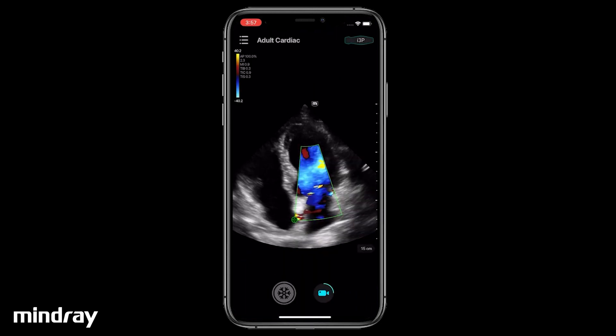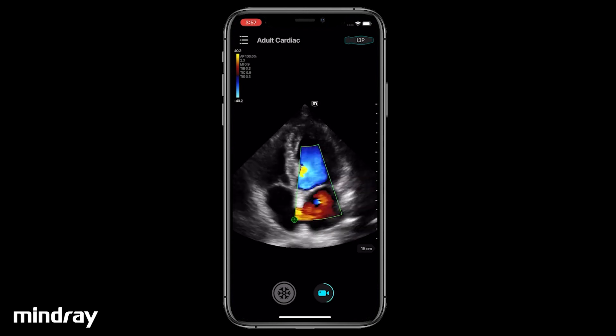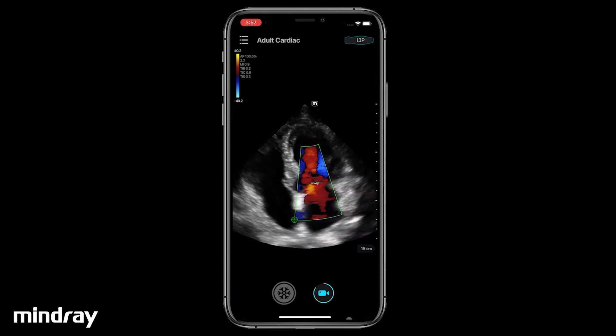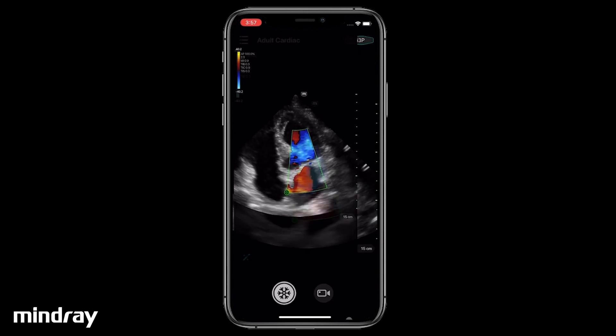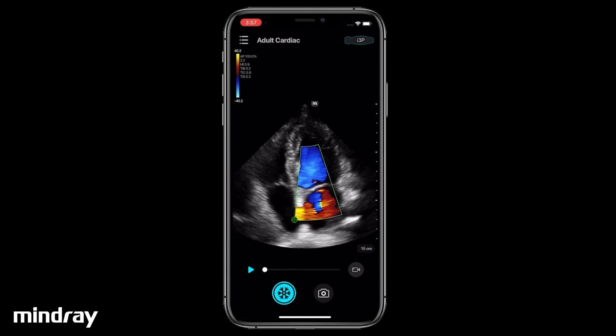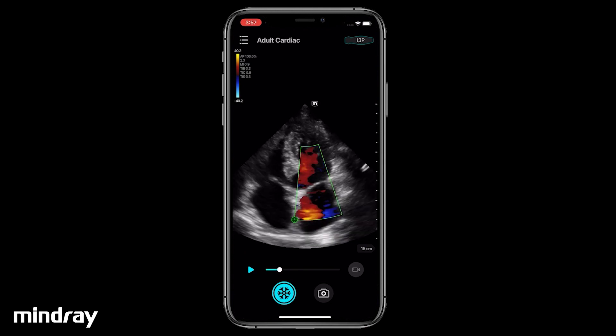Tap the Video Camera icon to save a Cine in real time during scanning. After freezing, tap the Play button or drag the progress bar to review the current Cine.